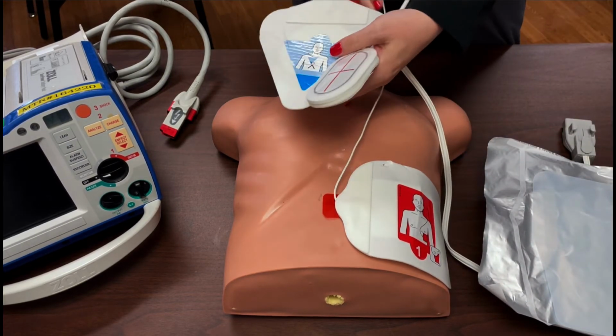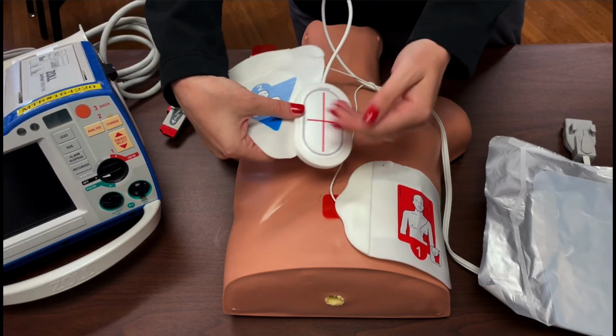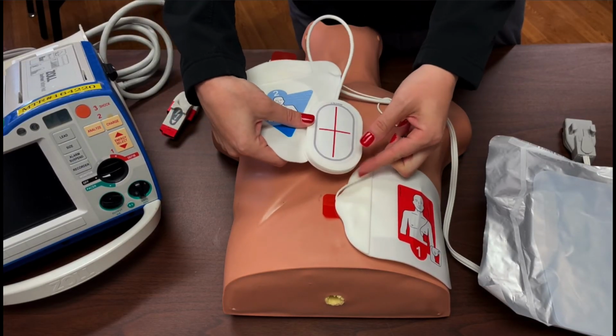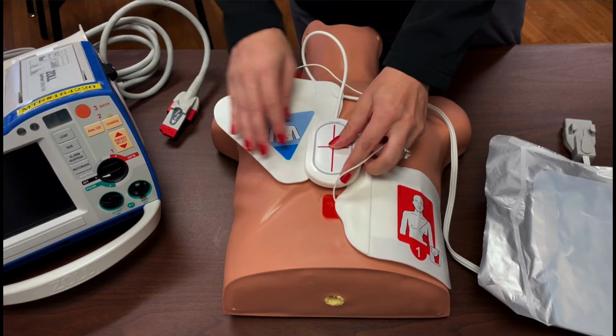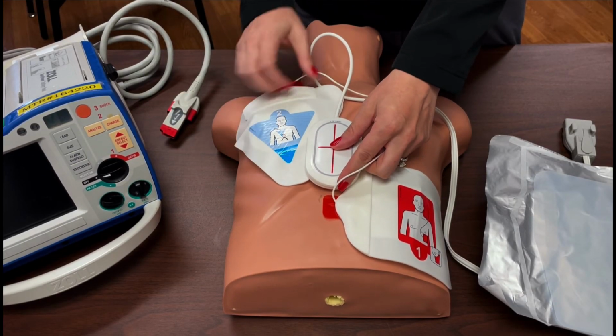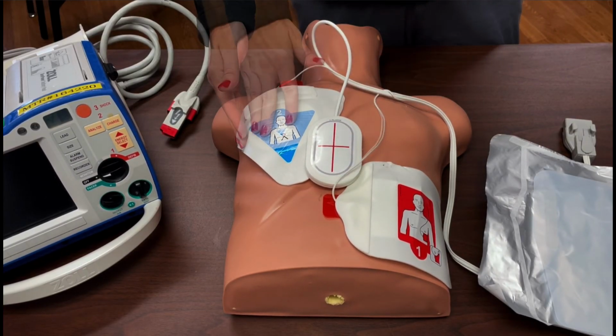And then taking care not to place it over the wires, you're going to align the puck, the cross here, where you would normally be placing your hands for CPR, so right at the patient's sternum. And then the triangular blue pad should fall into place on the patient's right pectoral under the clavicle.